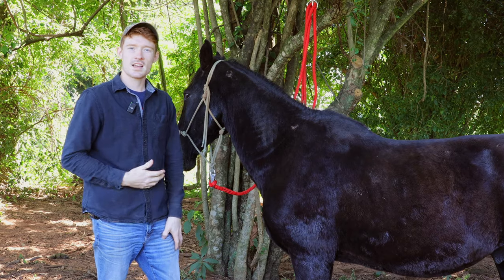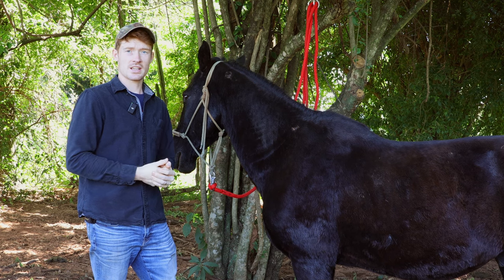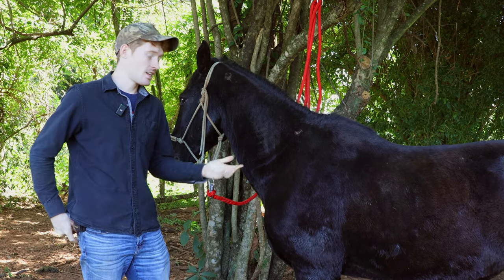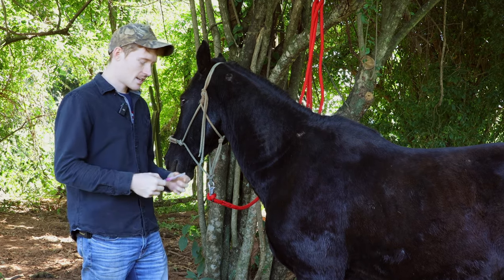So this horse doesn't have a good foundation of groundwork — he's very hard to catch. But we're going to go ahead and vaccinate him because he needs the shot as well, and we'll just see how he reacts. At least he's standing still here.